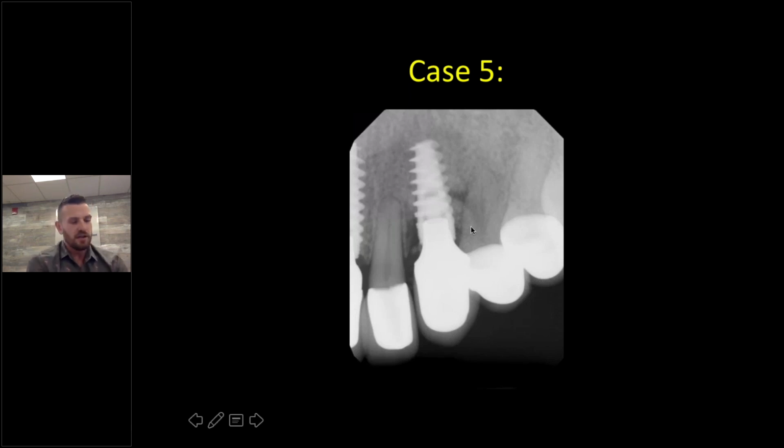When you see these, you just cringe, and it's unfortunate because it's in a patient who is very aesthetically driven. She has crowns from number 4 to number 13, and quite a few implants, but unfortunately this implant is failing, and we know it's going to have to be removed, especially since she had it previously treated with a laser.